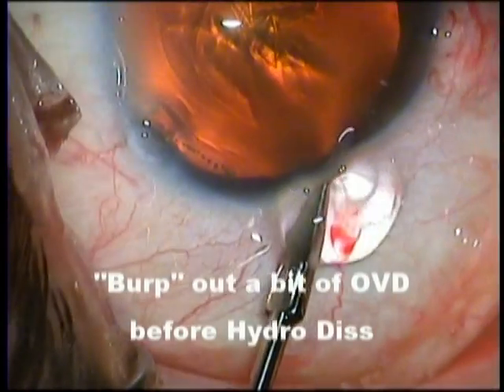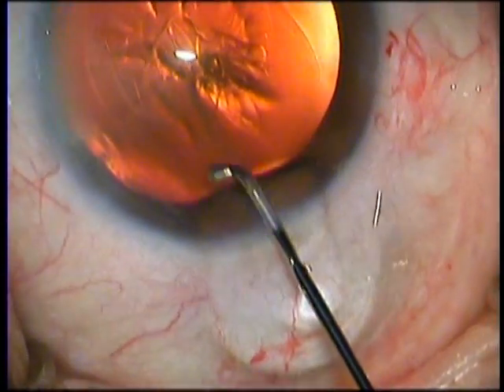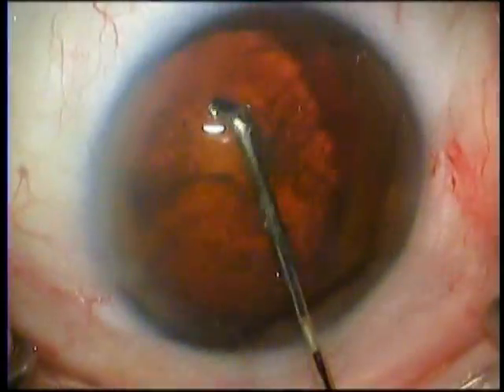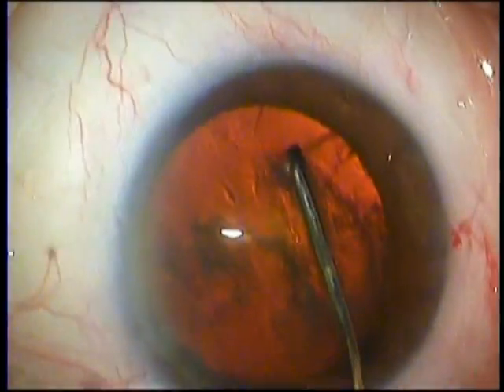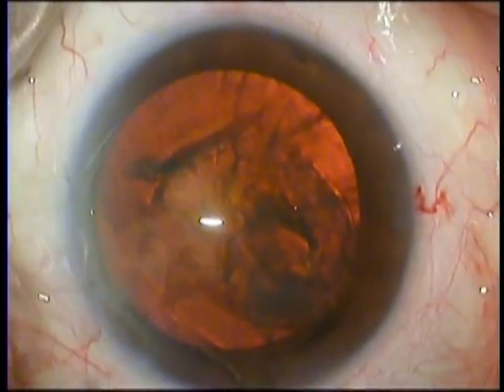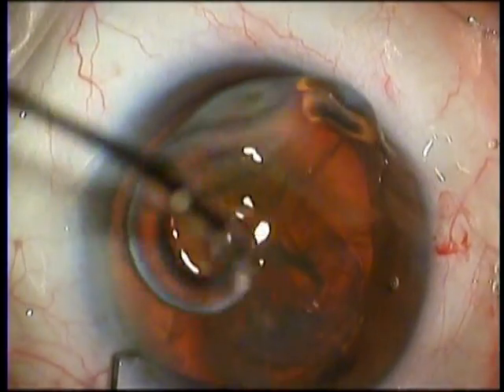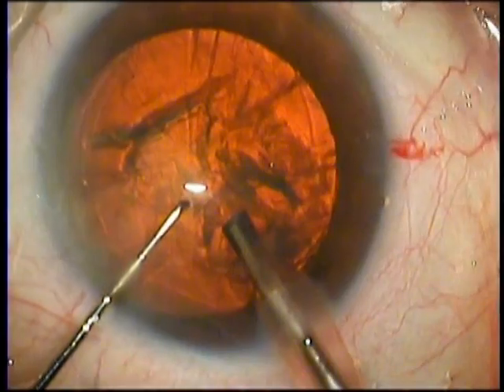The rhexis being over, we burp out a little viscoelastic from the anterior chamber so that there is enough place physically for the fluid wave to pass behind the lens. Using the Banaji cannula, we go towards the equator, gently inject and we get a fluid wave immediately. The lens is decompressed now, and with the same cannula we hook the tip into one end of the lens and rotate it, and then the other end and rotate it. If the fluid wave has been observed to go around the equator and come out through the rhexis opening, you will 100% be able to rotate the nucleus with the greatest of ease. Note that we have hydrodissected and rotated the lens with the same cannula.